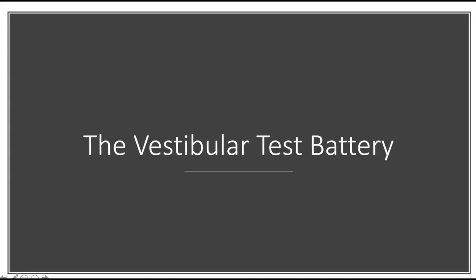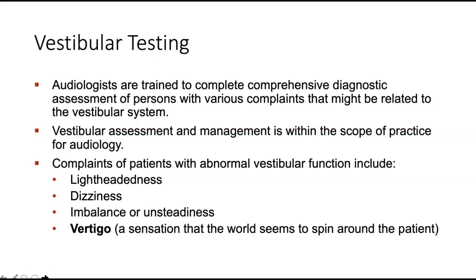Now, the vestibular test battery is a balance assessment. It is an assessment of the vestibular system, which governs our balance. As audiologists, we are trained to provide diagnostic testing of the vestibular system.